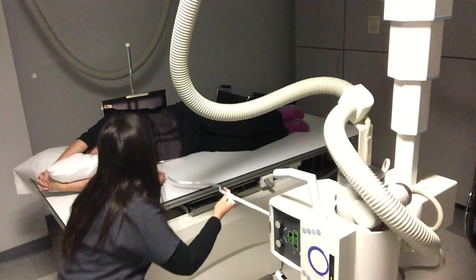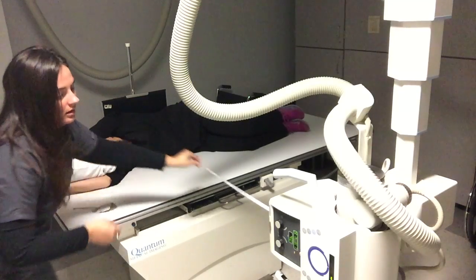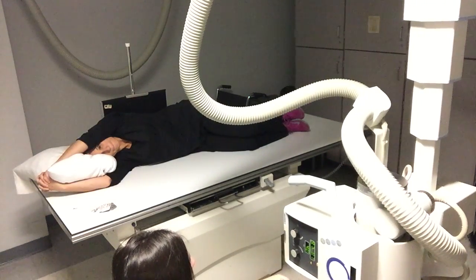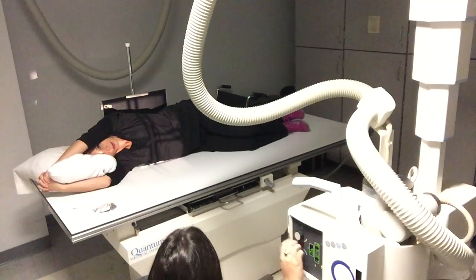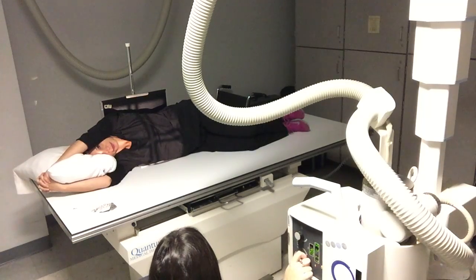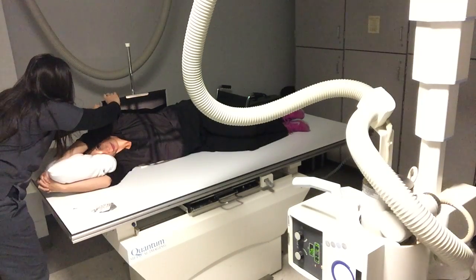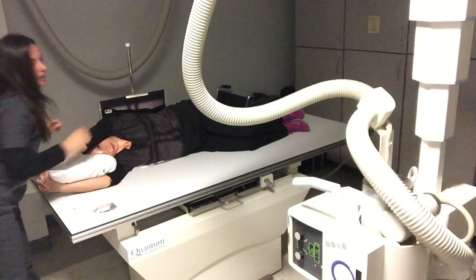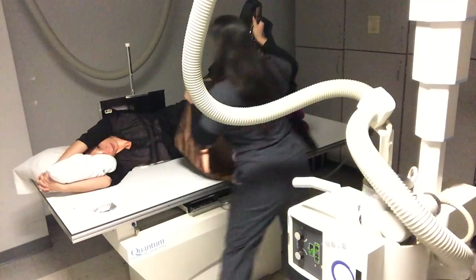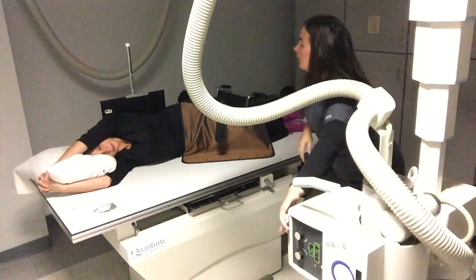We would also be using a grid for this study. I was able to get 70 here and backed up a bit more to reach 72. I'm collimating in tightly, so I need to move my marker — I'll move it behind her shoulder where it's still out of the way. I'm also going to grab a shield and shield my patient.